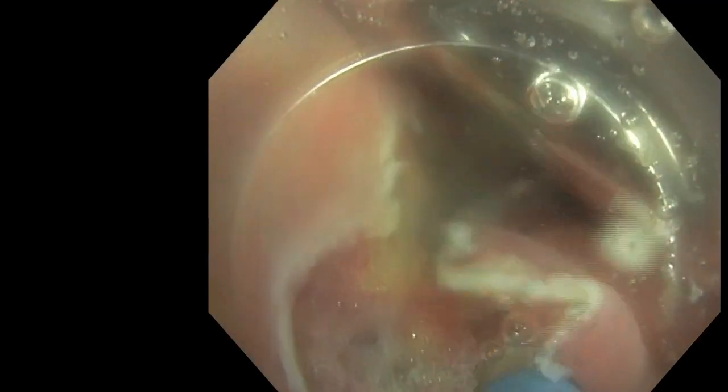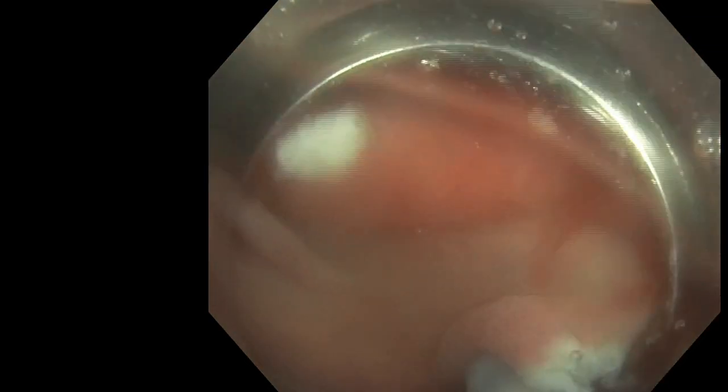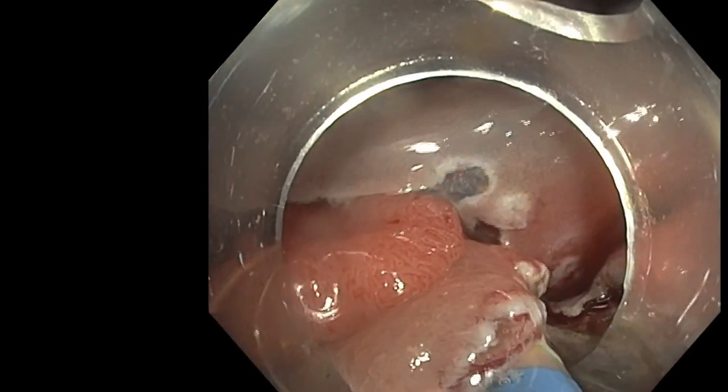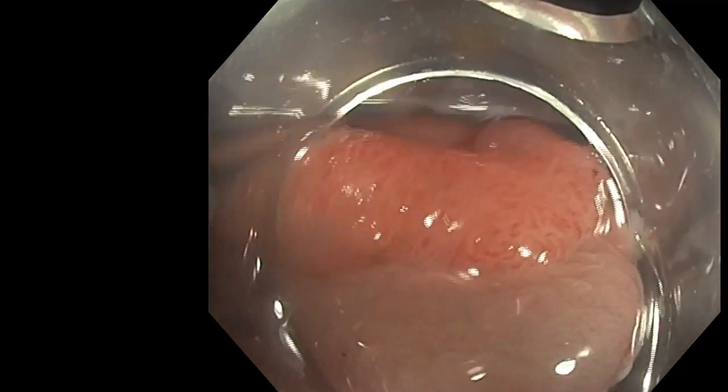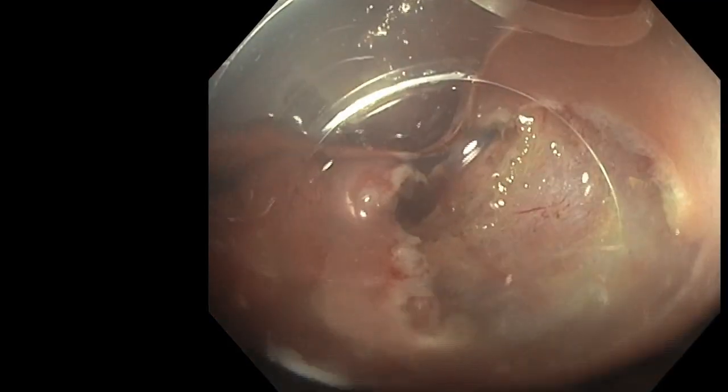So here, it's a little blind incision, but it's sometimes needed to open the space and be able to go under to access the submucosa. So I inject, and I try also to inject by opening the space, and after I try to do a blind movement, but always moving on the opposite side of the muscle. I like to have a quite large flap in order to fix the traction without any risk of trapping muscle while catching the edge with the clip.